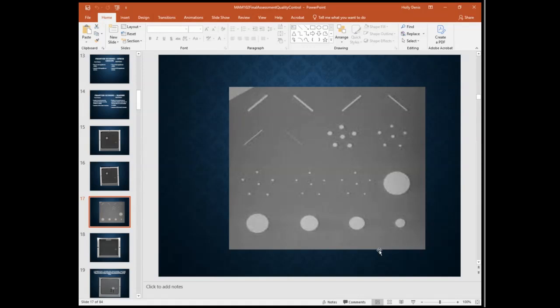So this one's really clear. I can see everything. You can see that one good. Yeah, this one gets perfect points for me. So 1, 2, 3, 4, 5, 6 fibers. I see all 6 dots. That gets a full 5 points. All of these are complete circles, and I would give all those 5 points.